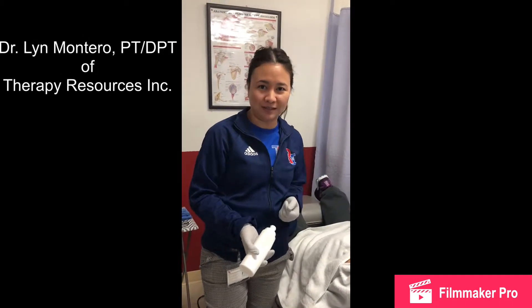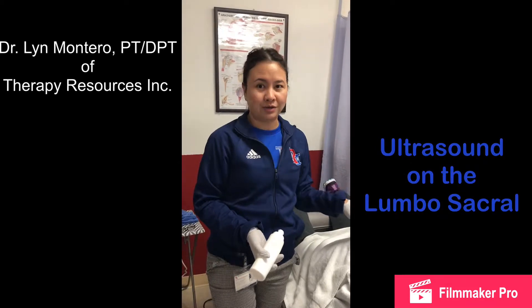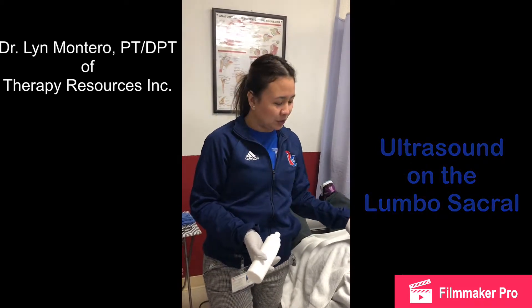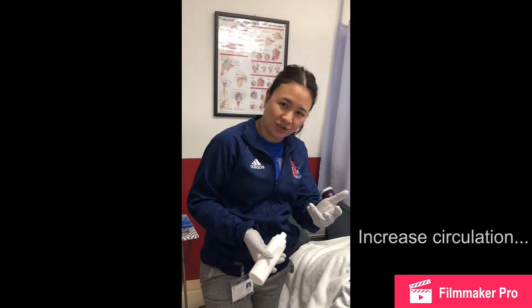This is Dr. Lin from Therapy Resources. We're going to do ultrasound on the lumbar sacral area. This patient has a slight increase in lumbar curvature due to some degeneration, more on the lower section of the lumbar area. We're going to use ultrasound to let the heat penetrate on those joints so we can increase the circulation, which will help decrease the pain in the area.